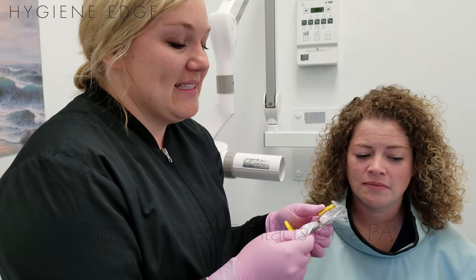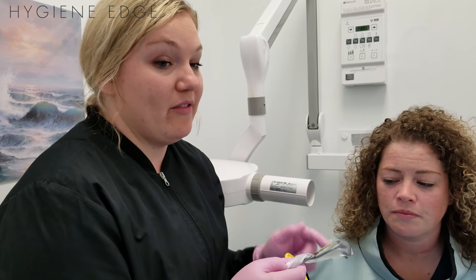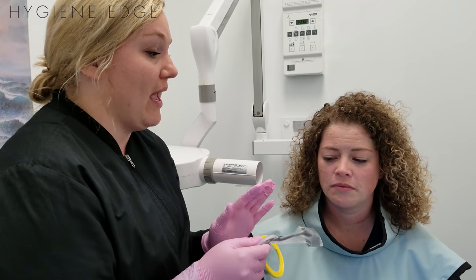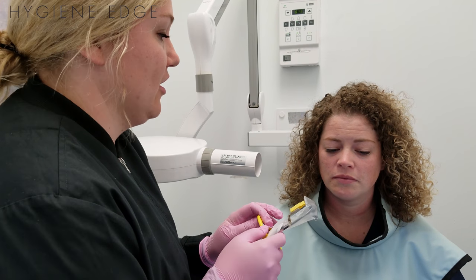One other trick with PAs is that you can have horizontal angulation issues. You can have overlap, and ideally you don't want any overlap with a PA. Sometimes it's not possible, but ideally no.